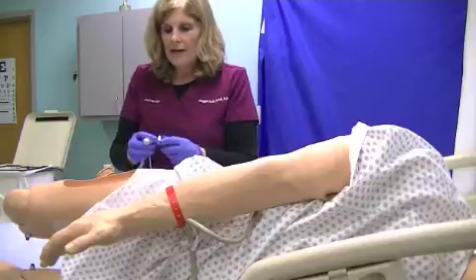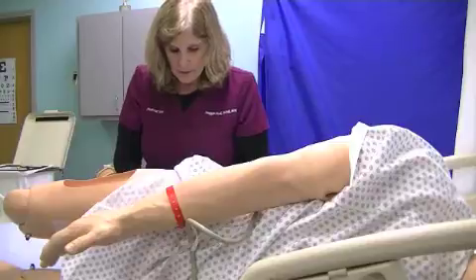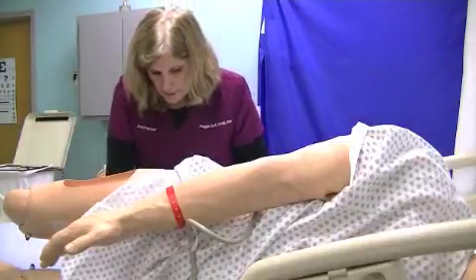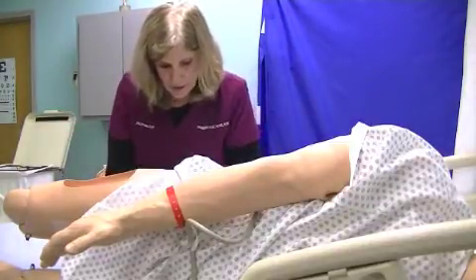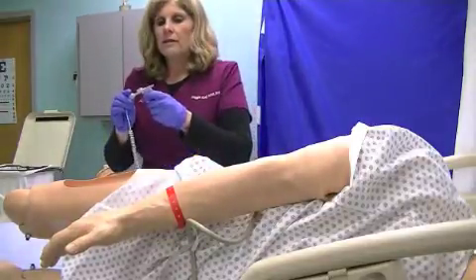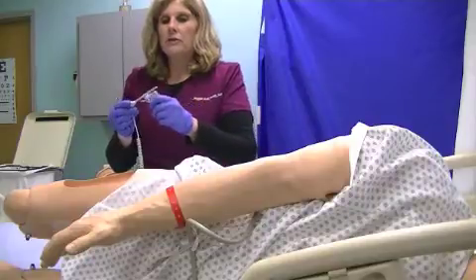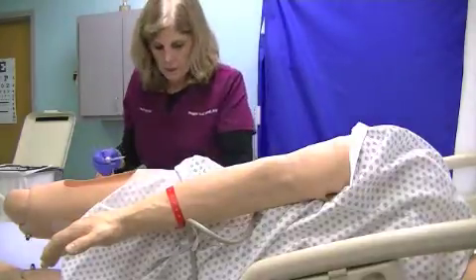I'm going to lubricate with KY jelly. Since it is water soluble, I'm going to make sure I lubricate it, because if I don't lubricate it, it's going to cause the patient injury to the rectal mucosa. So I'm going to make sure I put it on.